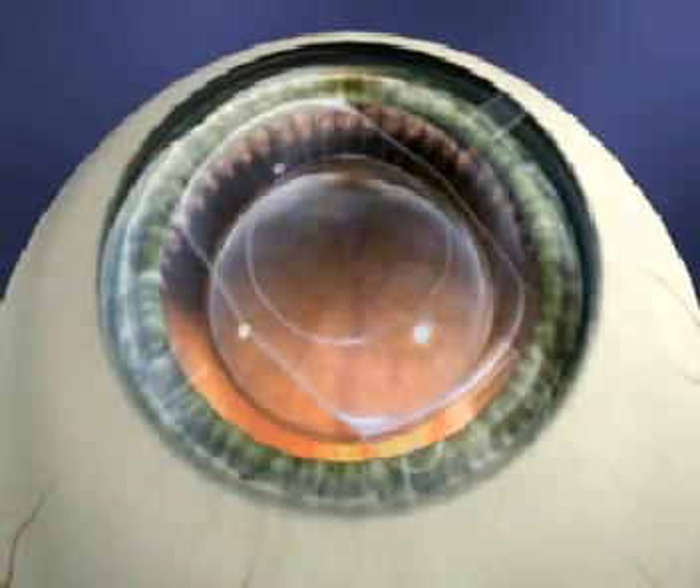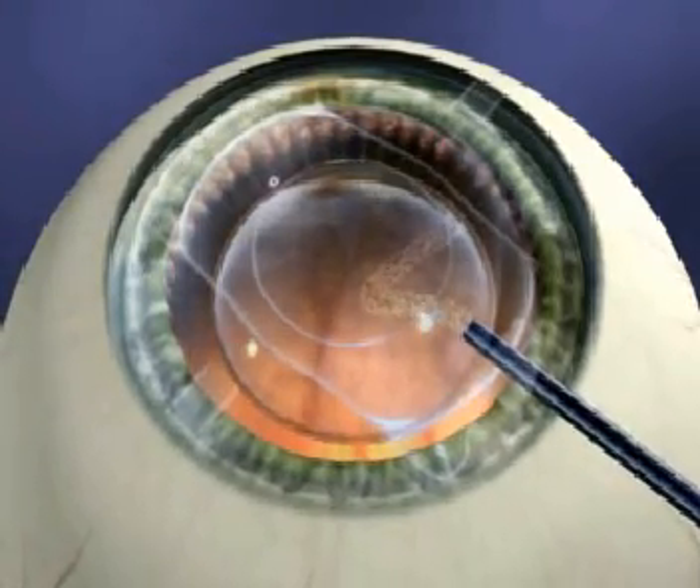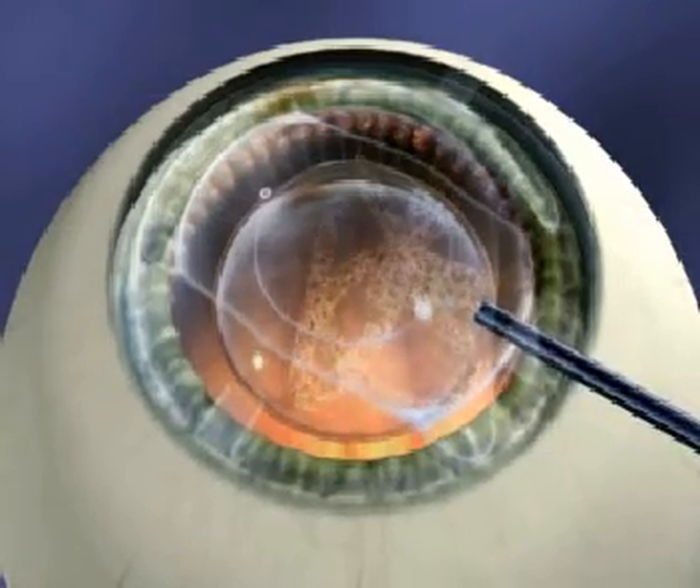If the ICL unfolds with the landmark on the left, it will be delivered upside down and will require removal, inspection, and reinsertion.